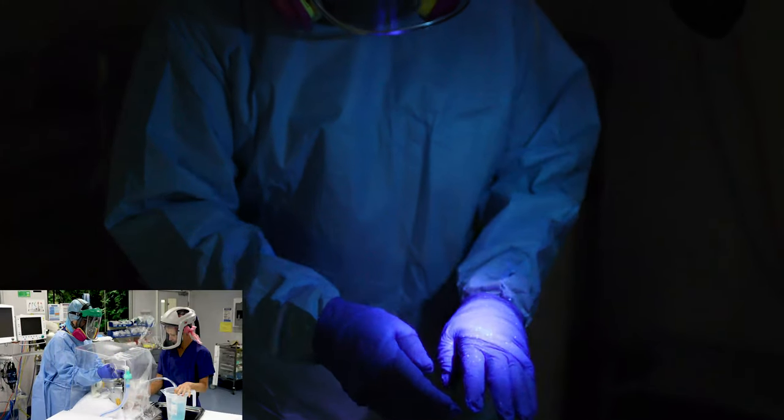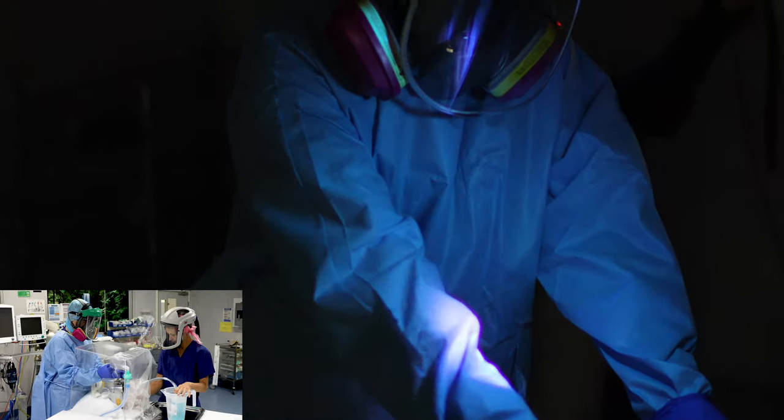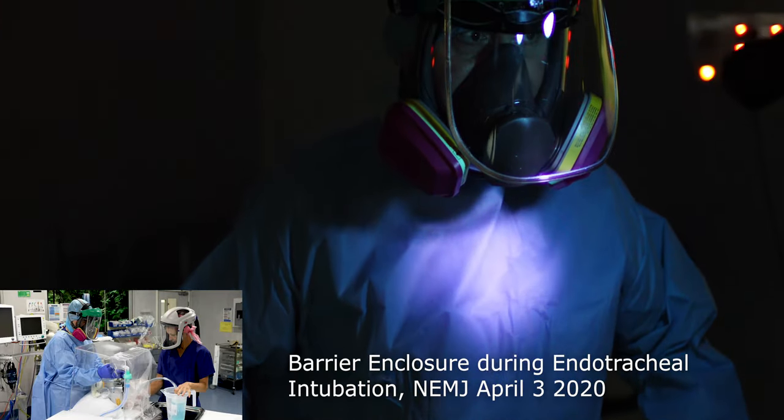Simulated intubation in a perspex box resulted in mild contamination of hands and forearms. There was a streak on the gown which may have rubbed off from my forearm. These data are similar to those reported in the NEJM.